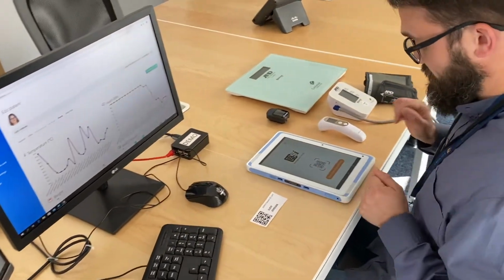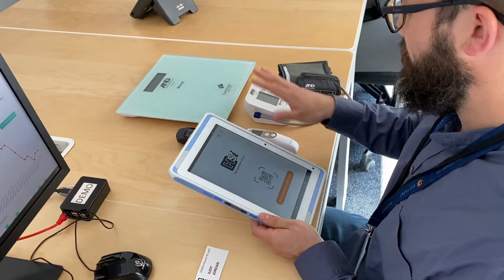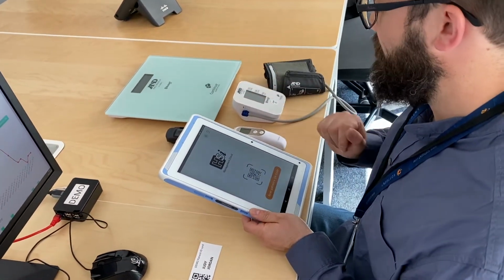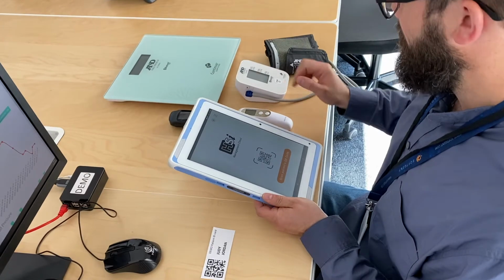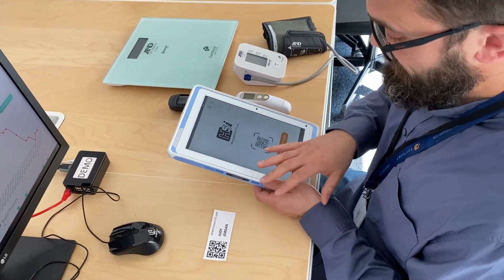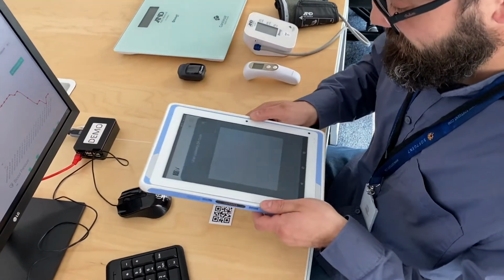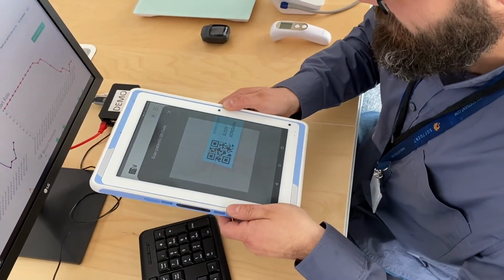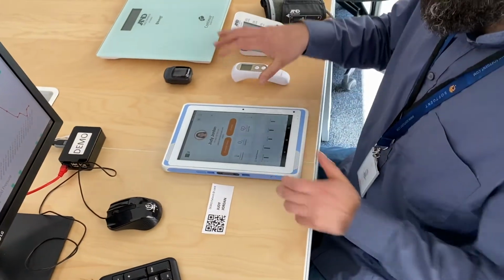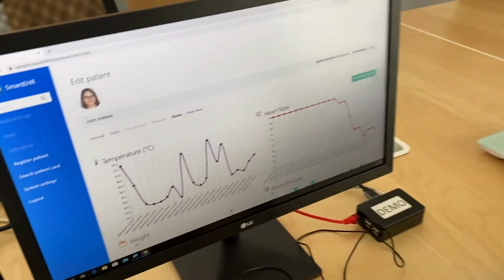Let me play with the system really quickly. So I will use this mobile app. This is an interface for patients that allows them to verify the status of the measures and confirm whenever it works, and so on. It's designed to support multiple different patients. So I will use the patient ID card that I prepared. I will scan it. At this moment, I will log into this particular patient, Jordan, and you see the same patient that we're using in the electronic health record system, right?